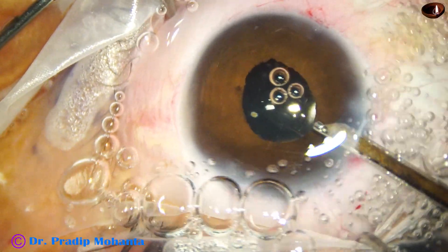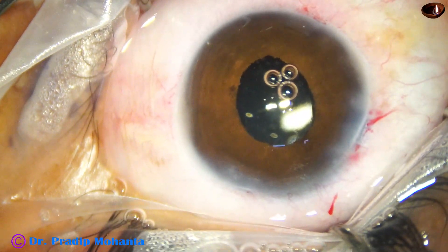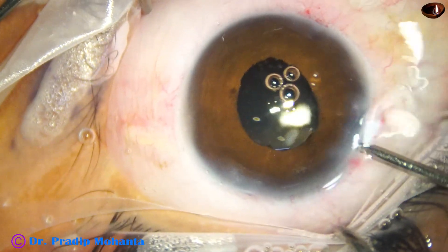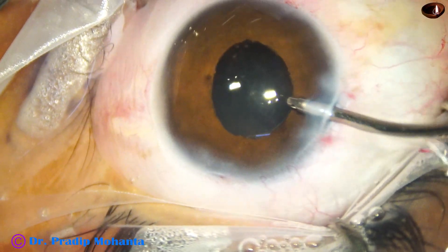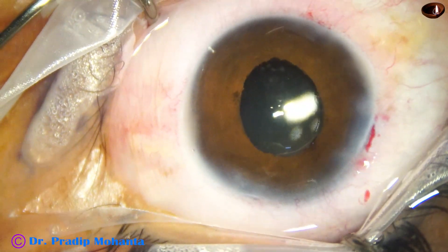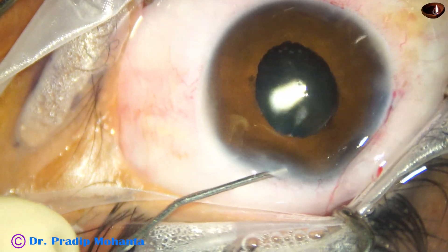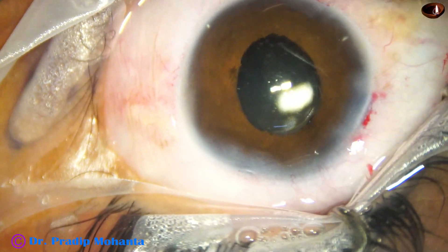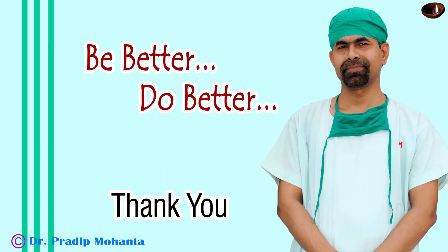There are some air bubbles, and I want to give a thorough wash of the anterior chamber because I think there are a lot of Kenacort particles remaining. So I take the irrigation cannula and give a thorough irrigation of the anterior chamber, and the air bubbles also come out. And now this is moxifloxacin — hydrating the side port with moxifloxacin, and some portion of the moxifloxacin goes into the anterior chamber. And now the case is done. Thank you very much for your attention. Hope this video will encourage you to take up such cases. Bye bye.